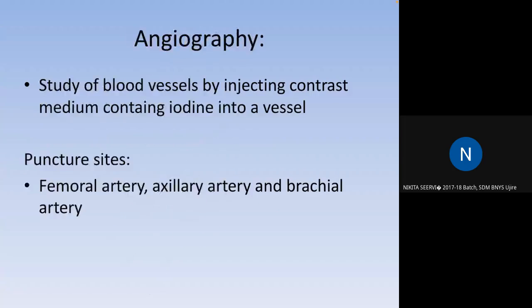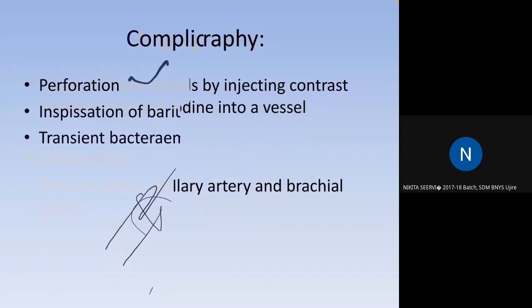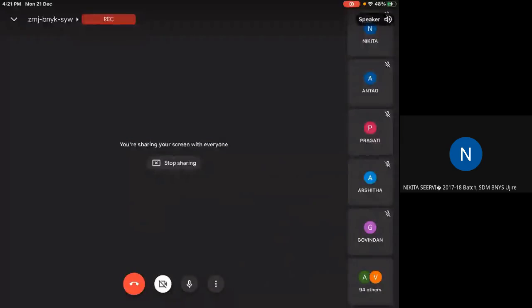Okay. Next, we have finished contrast based on barium, and we have finished bronchogram. We have finished myelogram. Basically, those two in a very superficial way. Next, we come to angiography. What is angiography? Come on, what is angiography? So viewing blood vessels.